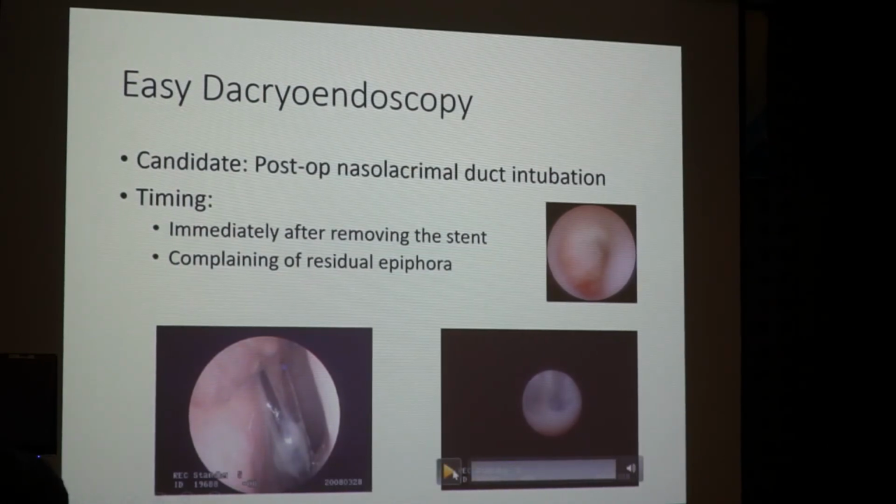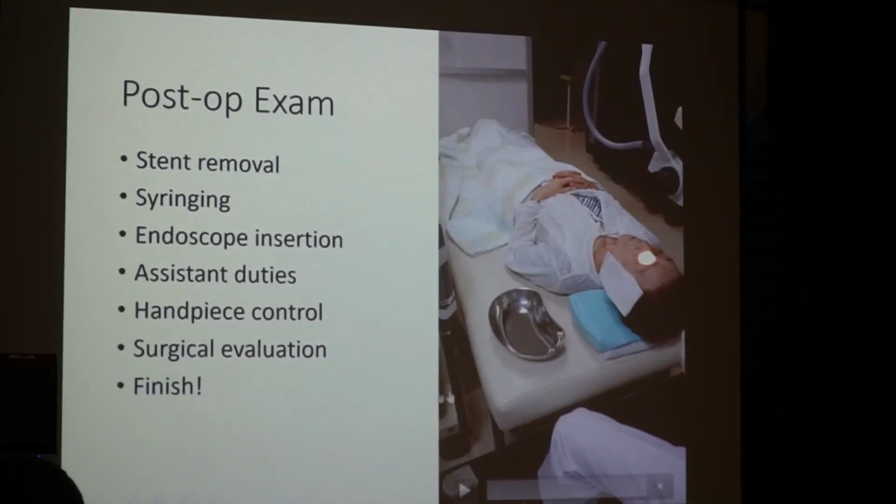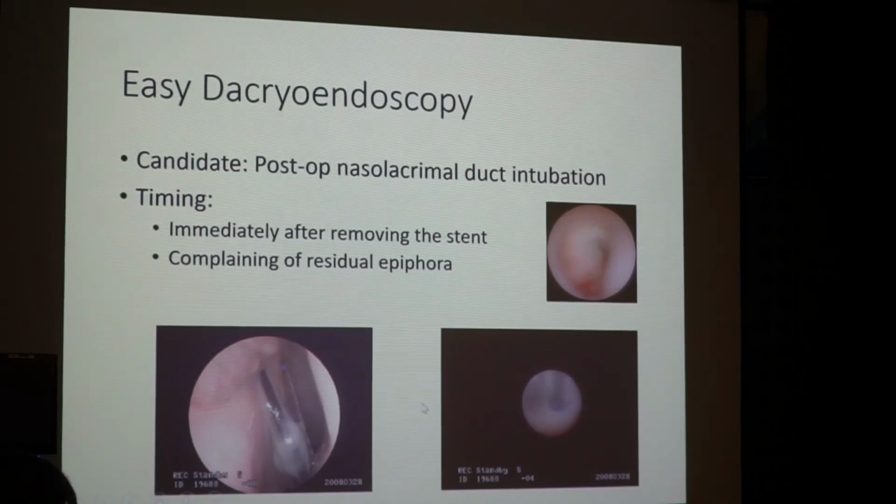However, with lacrimal endoscope, the truth is not one end. Lacrimal endoscope reveals that both ends are inserted in the false passage. Original track is this one. This is the original track. So lacrimal endoscope sometimes reveals this kind of strange false passage.